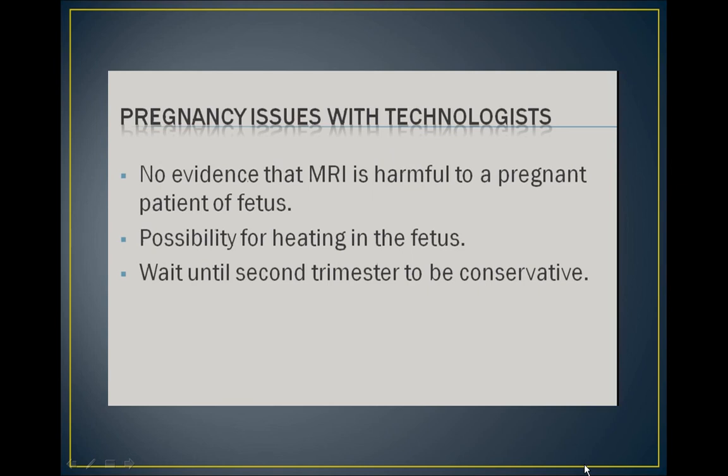It is important to maintain constant communication with any patient who has these types of particles or tattoos, and make them aware of the possibility of heating. The MRI tech must be told as soon as possible if heating occurs, so the patient can be removed from the MRI suite and evaluated promptly.